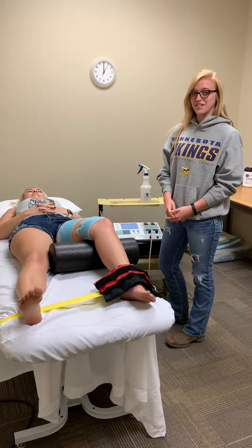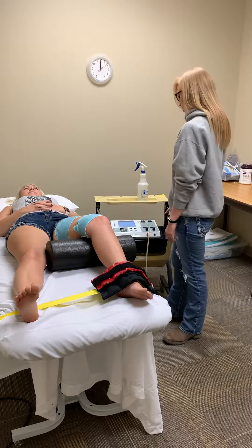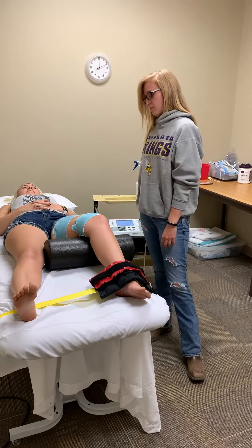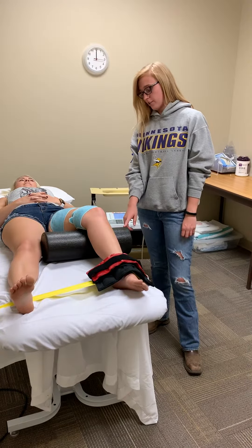My name is Haley and we're doing NMES burst alternating current. This is my patient Lauren. We already set the parameters and have her supine with a bolster under her knee just to elongate the quad a little bit.